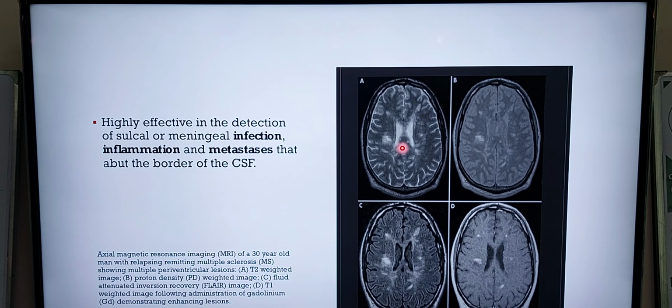It is also highly effective in the detection of sulcal or meningeal infection because it enhances the meninges and metastasis that abut the border of the CSF.